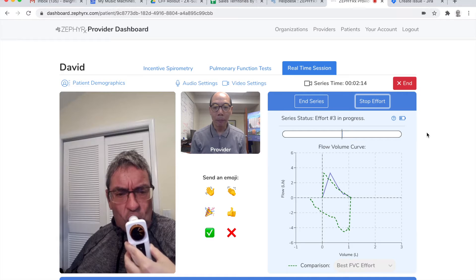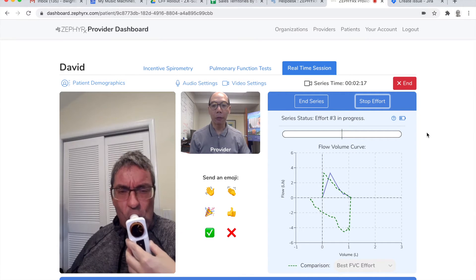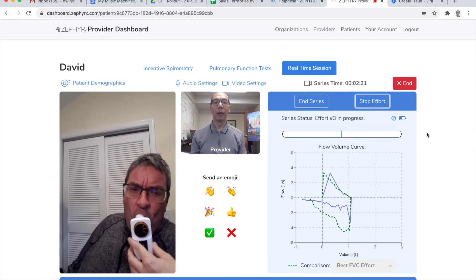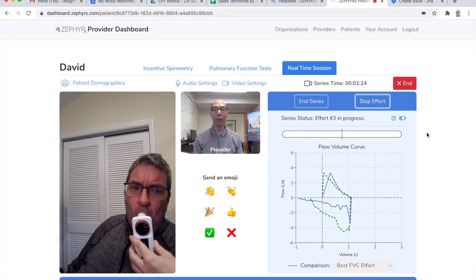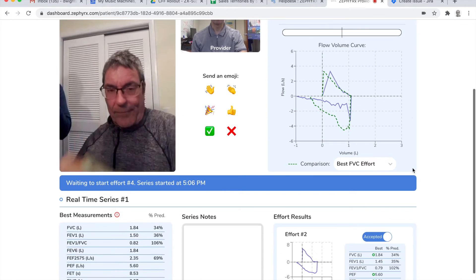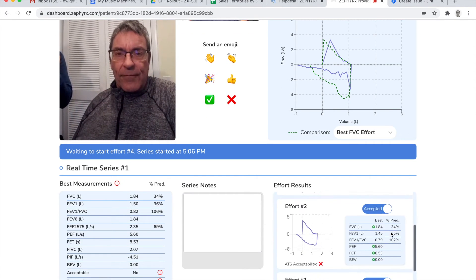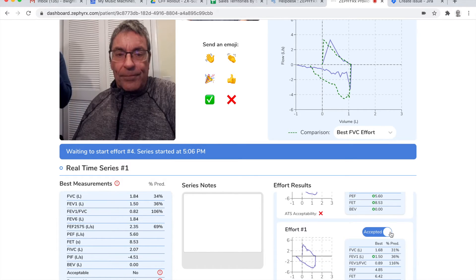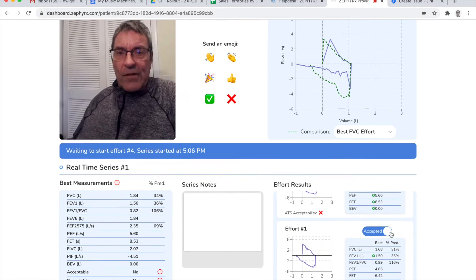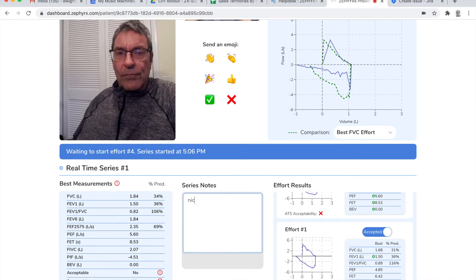Nice. And then when you hit your bell, inhale. Okay. Way to go. Nice job. Nice job. Let me check the results here. Okay. I'm going to put some notes here.